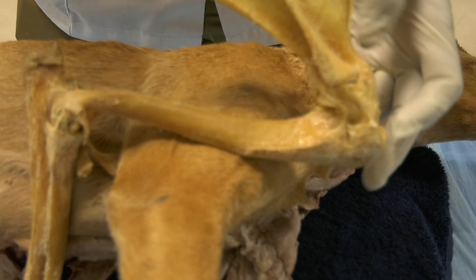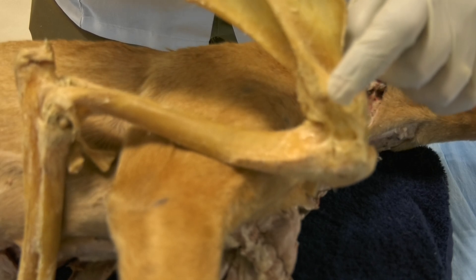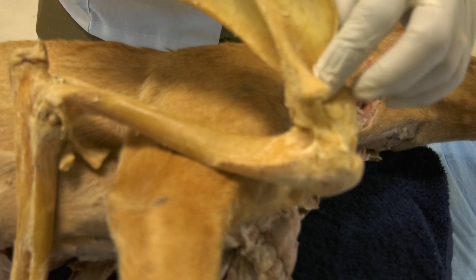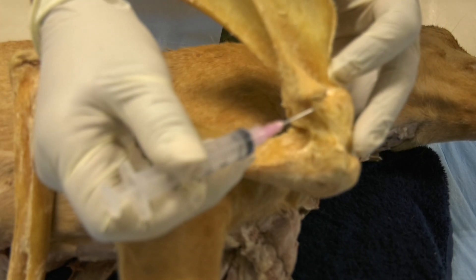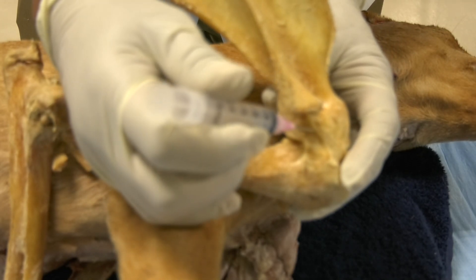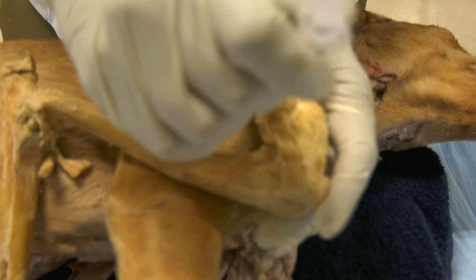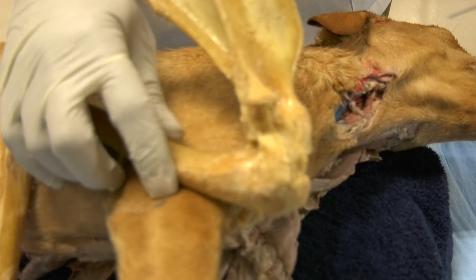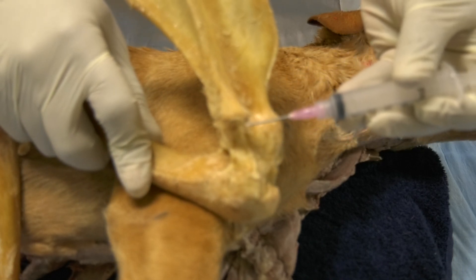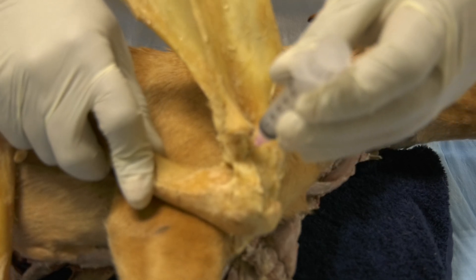Starting with the shoulder joint, the landmark is the acromion at the distal end of the scapular spine. You palpate the scapular spine, go distally until you feel the acromion, then go just a few millimeters distal to the acromion and insert your needle perpendicular to the skin in a medial direction. This will give you access to the joint cavity.